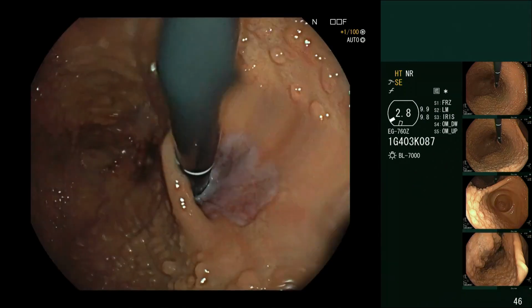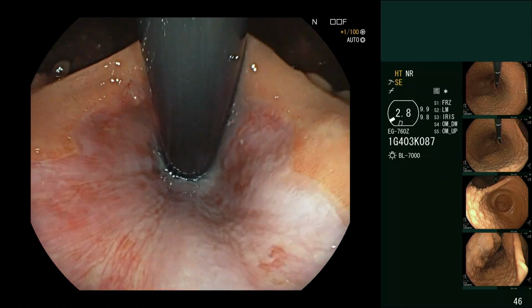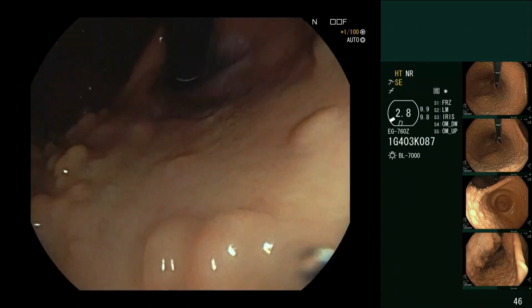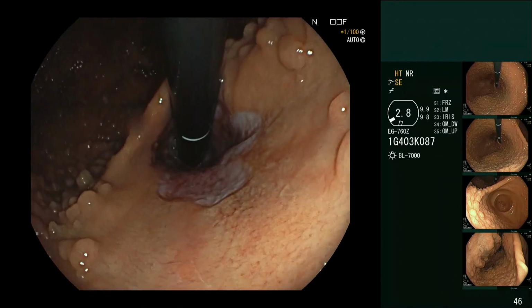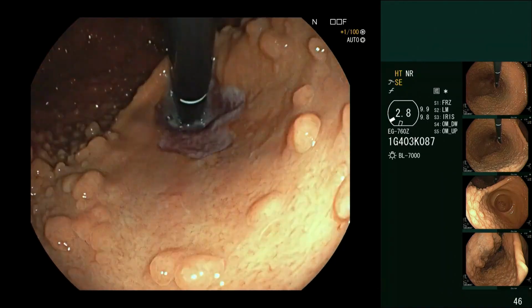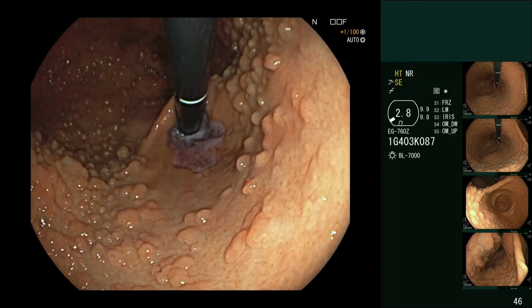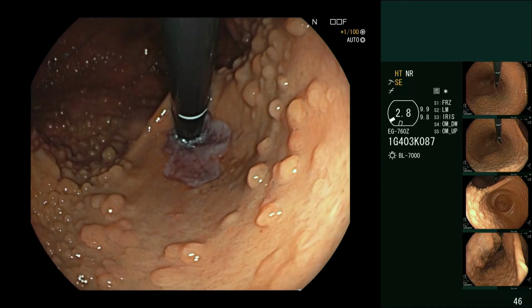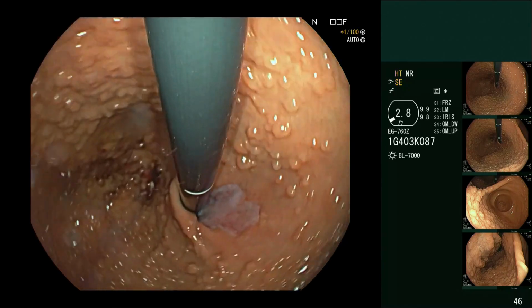So we can pull the scope right up into the gastroesophageal junction. We can look for junctional lesions because patients with FAP definitely get junctional lesions. I personally have missed a cancer in this location before, and those eagle-eyed followers of Geeks will remember that it was detected by one of the visiting faculty at, I think, Geeks 1 or 2, and it was in this location, okay? So I had done the gastroscopy before. It wasn't there for me, but probably it was. It was just too small and I overlooked it.